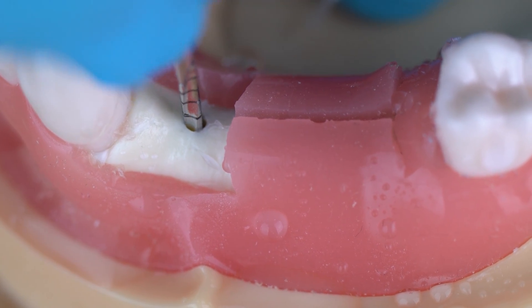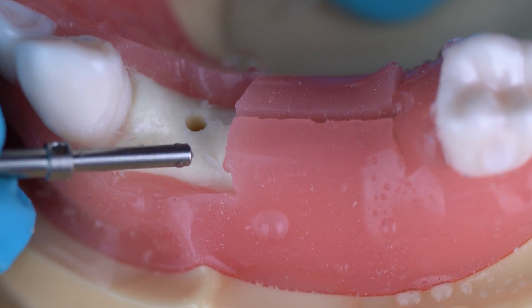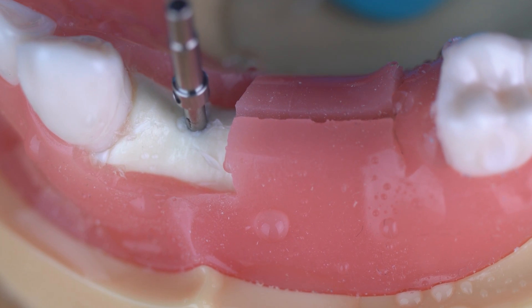Now take the drill out and put your parallel pin in. This is the parallel pin from the kit — just place it inside the preparation. Then it's time for an x-ray.